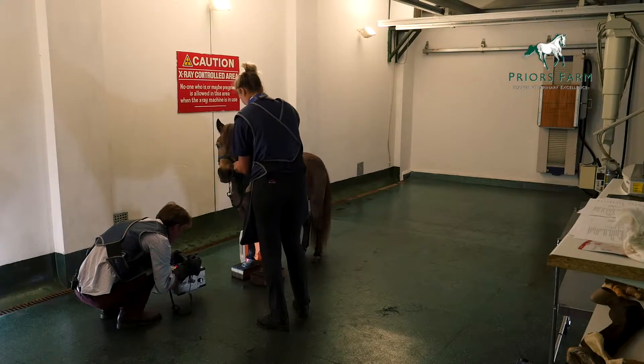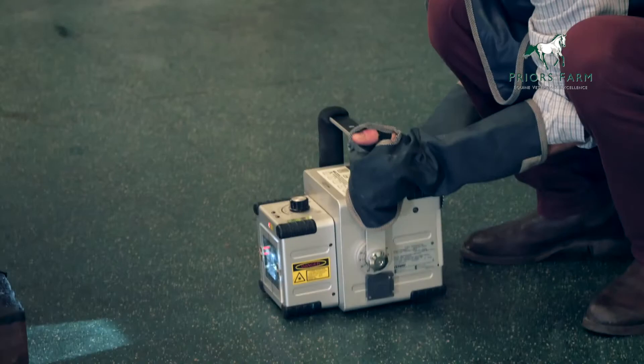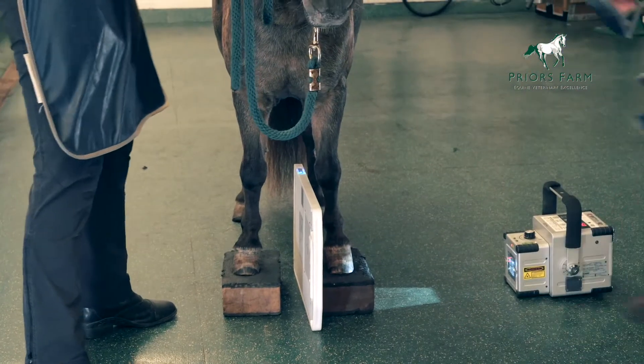Radiation safety is extremely important. There should be as few people as possible helping take radiographs, and those people who are helping should wear personal protective equipment such as gowns, gloves, thyroid protectors, and dosimeters.